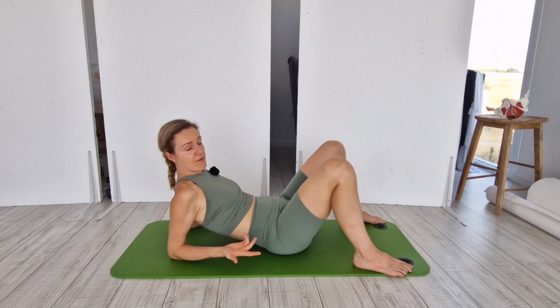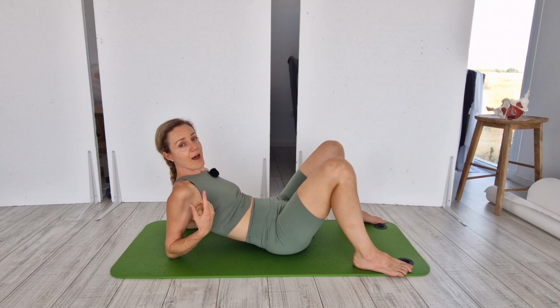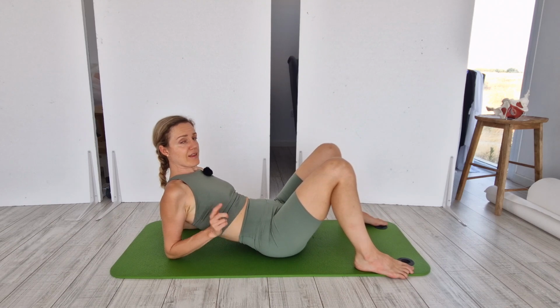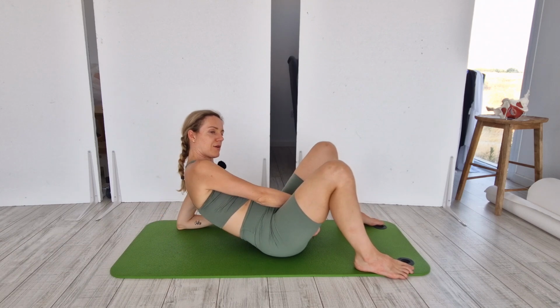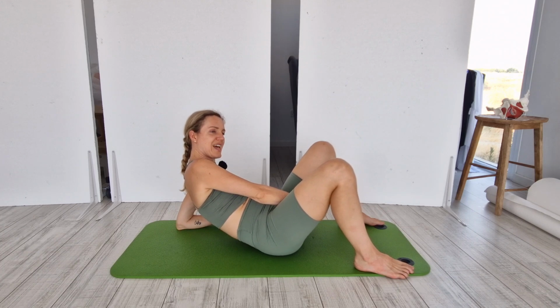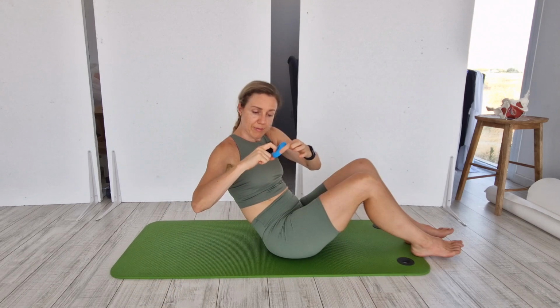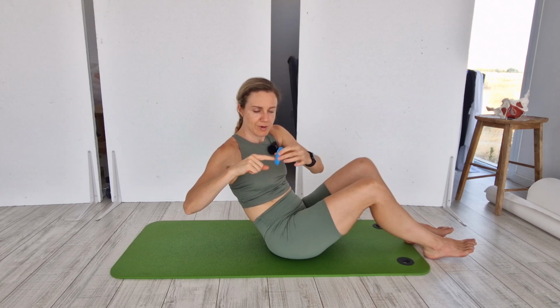So let's say I have a ring pessary inside, I don't have any little tails that I can catch the pessary on, so I have to go all the way into my vagina with my finger. I'm laying down here, and how can I help myself to make the process easier? As I reach inside, I can try to tilt my pelvis back and forth and see if it will help me to find one of the edges of the pessary. It can be the back edge and it can be the front edge. You can pull the pessary out from any edge really.